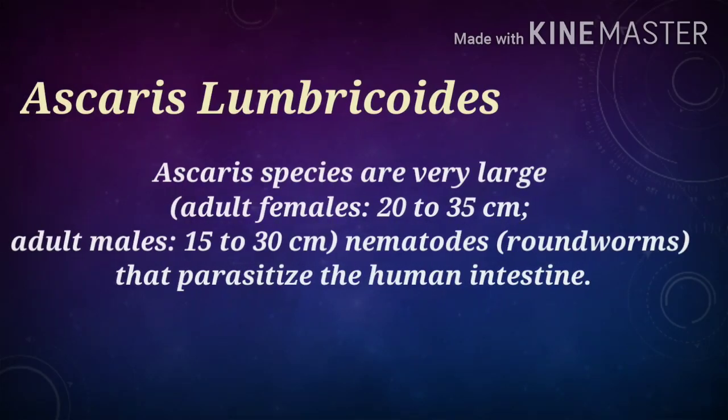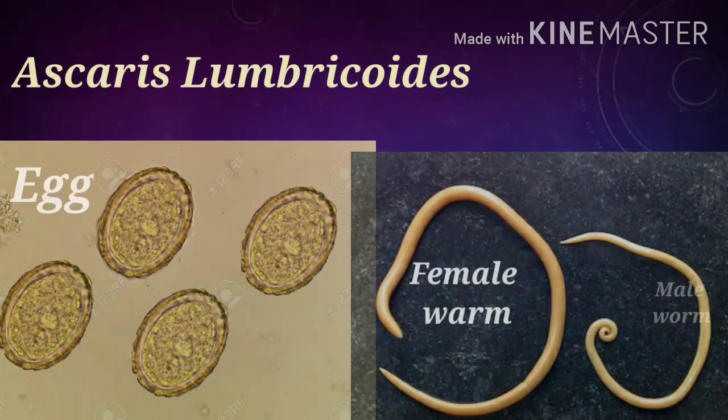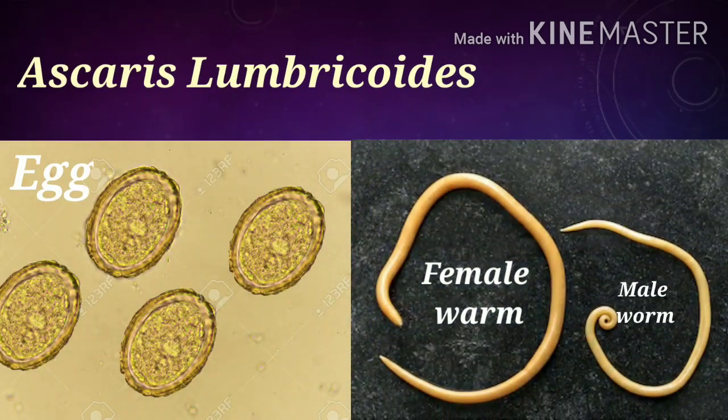The next one is Ascaris lumbricoides. Ascaris species has very large adult worms — the adult female worm is 20 to 35 cm, and the adult male worm is 15 to 30 cm in length. This roundworm parasitizes the human intestine. See in this picture.